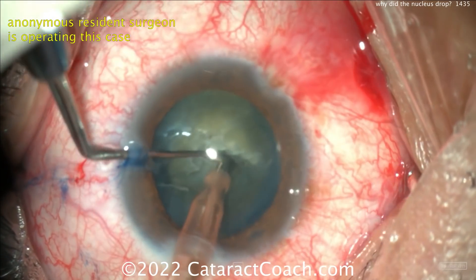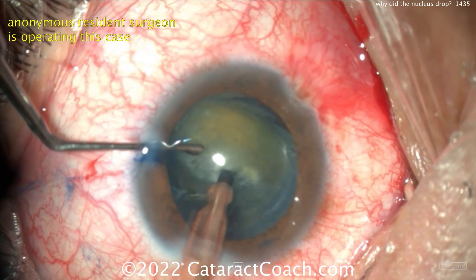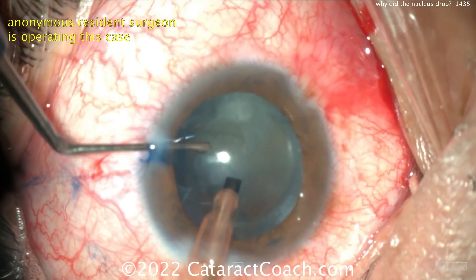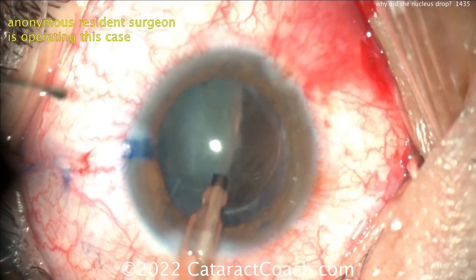This is going to go south. The more you manipulate here, that small little defect in the posterior capsule has now zipped around and it's got a huge, wide-open defect. Let's pause the video here and think about what's going to happen next. There it goes — watch carefully. The whole nucleus is now going to fall into the vitreous cavity.